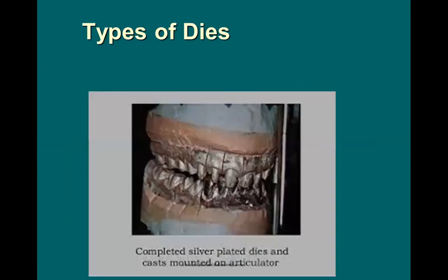The types of the dies. First of all, there is an old type, the silver plated dies.